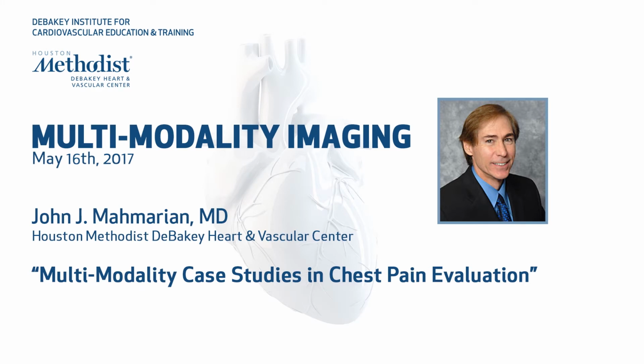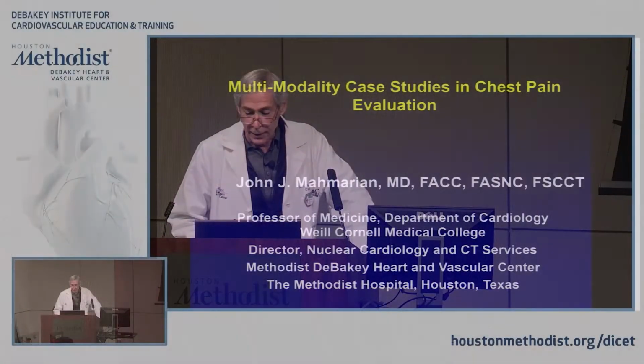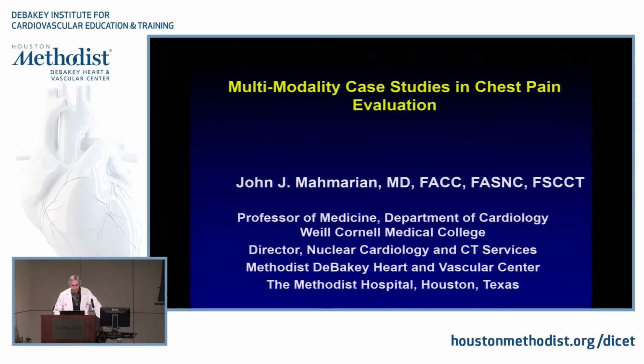Okay, well, today we're going to talk about just a few studies and how different things fit together in terms of CT and nuclear, etc. And so I'm going to just go through some cases.